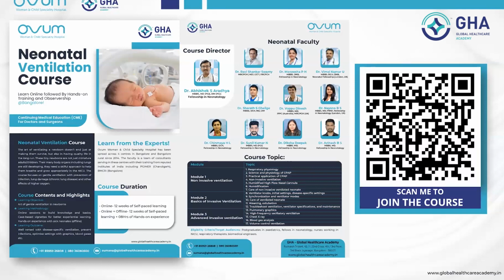There's a question asking to comment on indigenous CPAP being used in resource limited settings using a chest bag. So I'm a big no for that, although I was one of the proponents in the initial few years when I started my MD and DM. But I would suggest that now you have good machines which can give you blended air oxygen and good interfaces and also good humidification. So don't compromise.